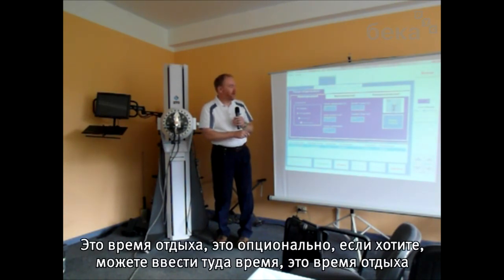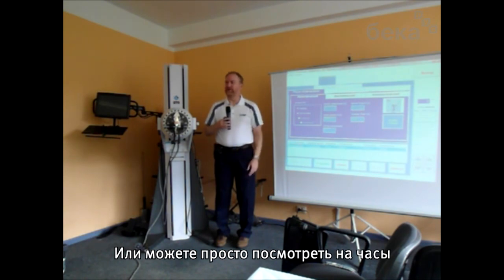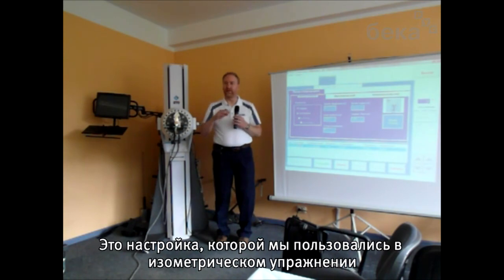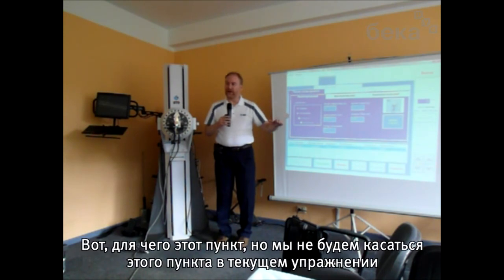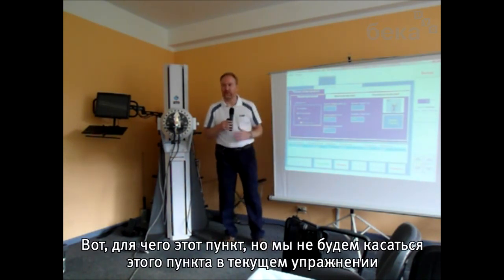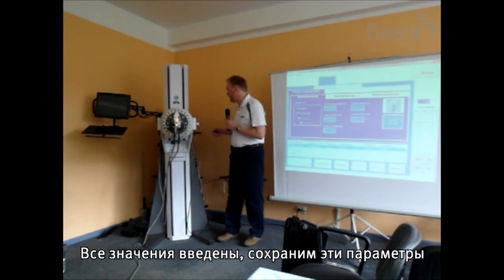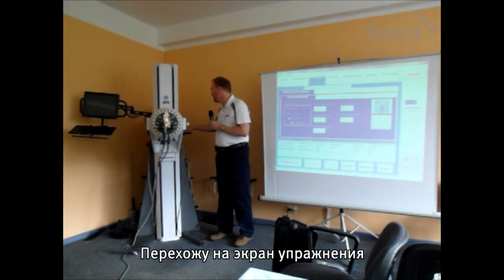This other information, rest time, it's optional. If you want to put a timer in there so that it counts the time between trials, you can do that. Or you can just look at your watch. That's what I do. But if you want to put it in, you can. I believe this is the target. That's the setting that we used for the isometric exercise, where you do a submax trial in exercise. That's what that setting is for. But we're not concerned with that right now. We're just doing maximum. So everything is entered. We'll go ahead and save those parameters, and then go to the test screen.